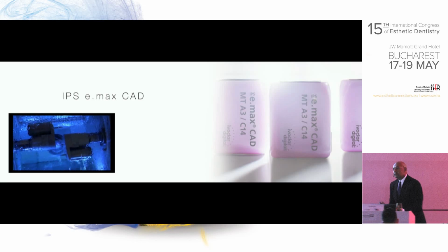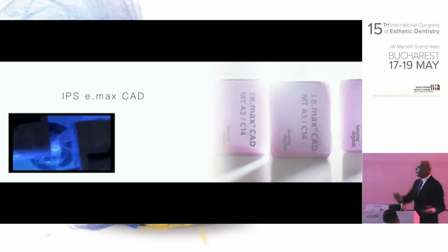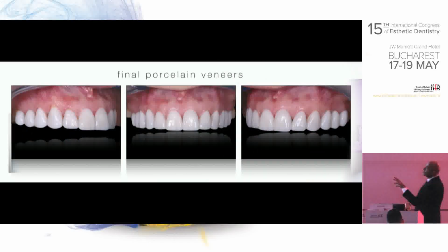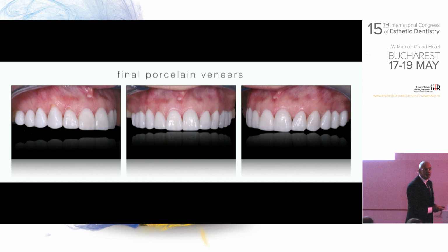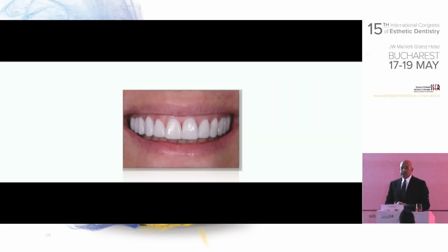Now, you have the choice of either going with a pressable ceramic or using the same STL file slightly modified to be used as a CAD-CAM. So if the patient was extremely happy with the outcome, just mill the porcelain teeth out of the same STL file, superimposing the wax-up over the prep design, and that will be the final design.